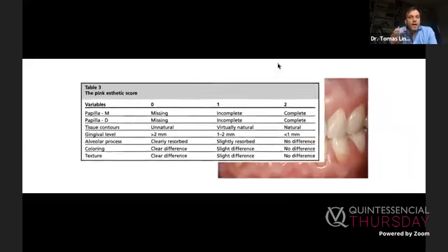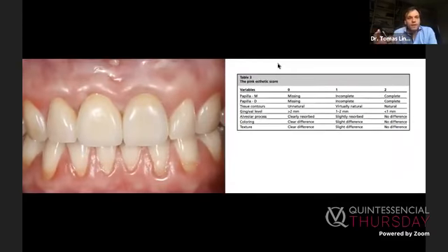When people say, I think that tissues look better around zirconia, what does better mean? Maybe in Lithuania better is this, and in Germany it is a different thing. So the pink aesthetic score is actually the only thing we can objectivize and make feeling into numbers in terms of aesthetics.